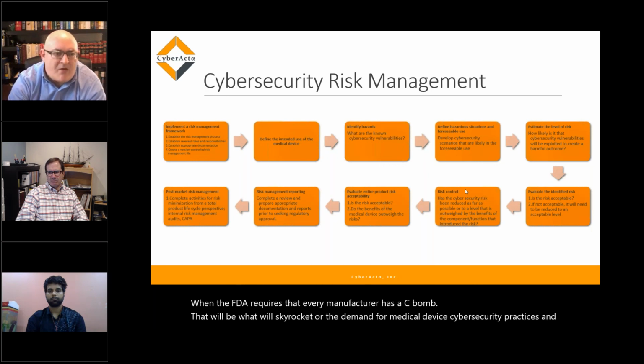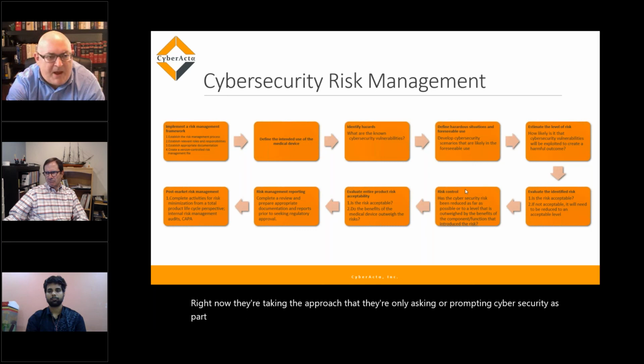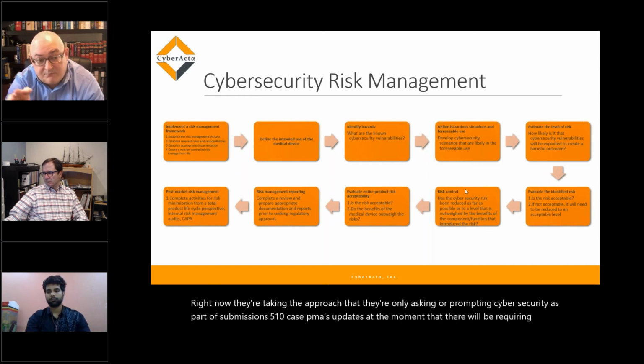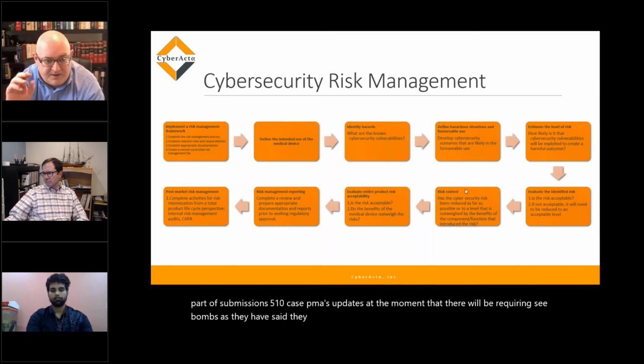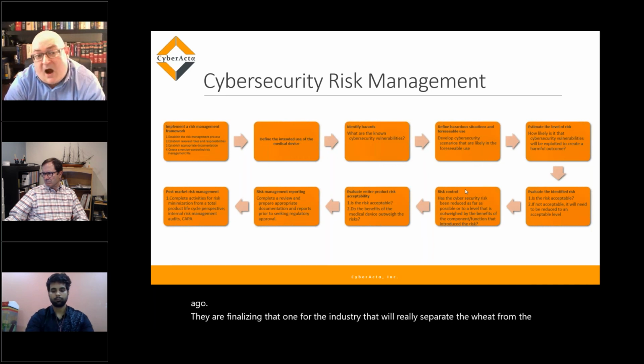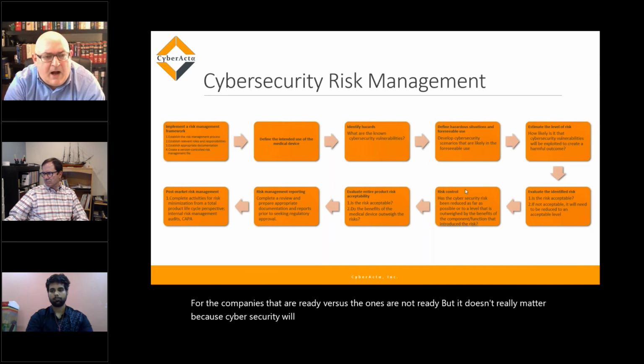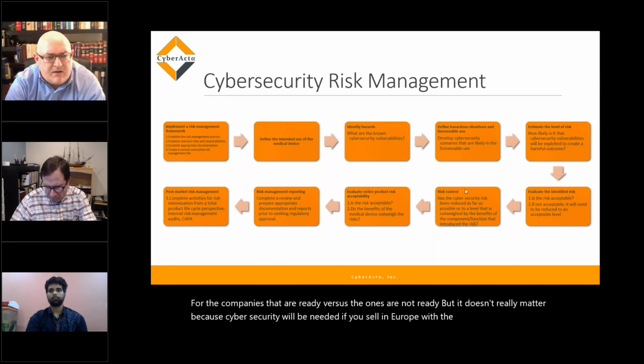Right now they're taking the approach that they're only asking or probing cybersecurity as part of submissions, 510Ks, PMAs, updates. At the moment that they will be requiring CBOMs, as they have said they will, and I was talking with the program director a couple of days ago, they're finalizing that one for the industry. That will really separate the wheat from the chaff for the companies that are ready versus the ones that are not ready. But it doesn't really matter because cybersecurity will be needed. If you sell in Europe with EU MDR, that is something that you have to have in place anyhow.